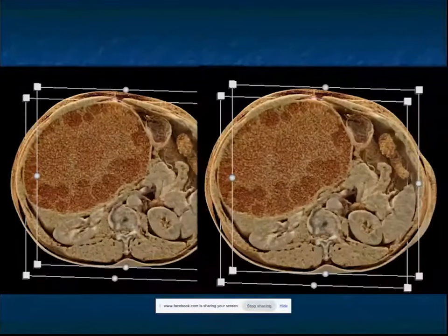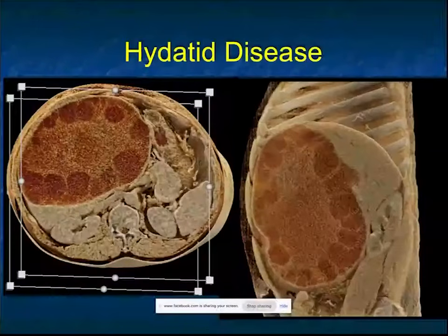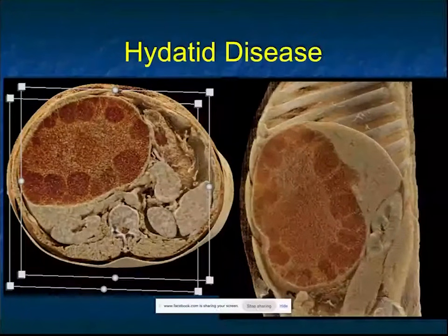And I said the vet, that's veterinarian, not a vet of wars. And so you have to say, aha, this patient's around animals. We got to be thinking something a little different. And this was a great case of hydatid disease. Really classic example.